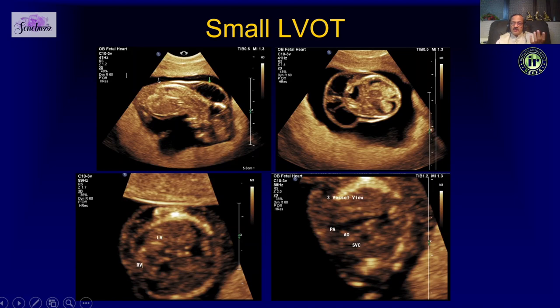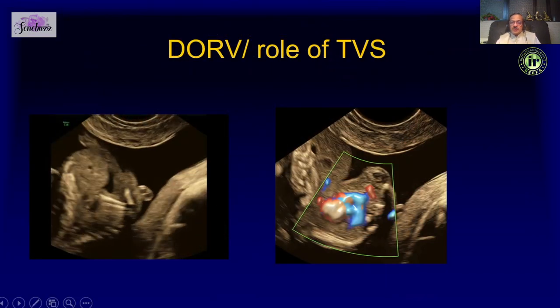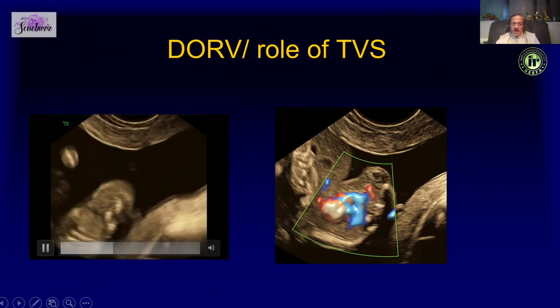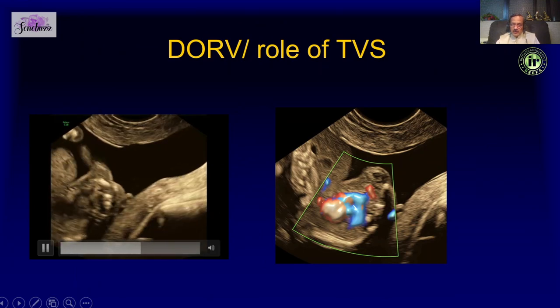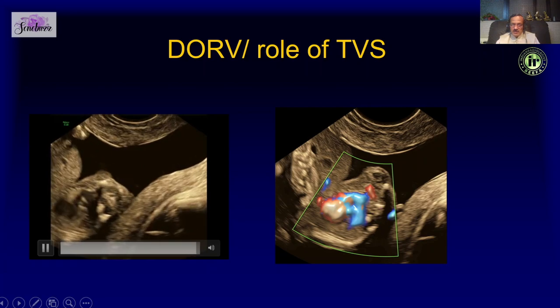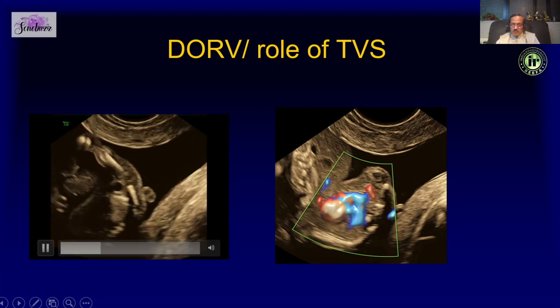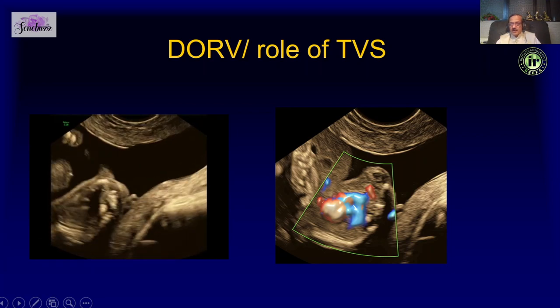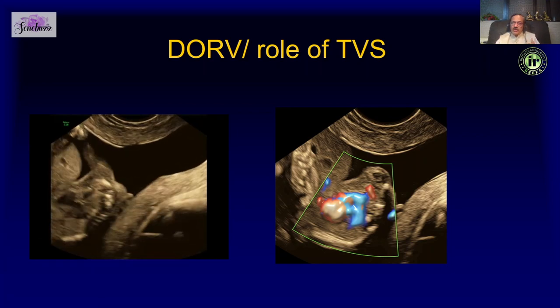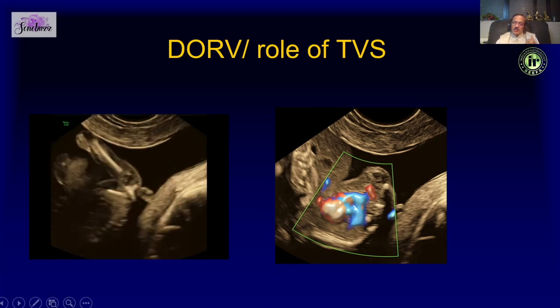This was a fetus with Turner syndrome. Here we have another fetus who had an omphalocele as well — you can see the right ventricle and a large aorta coming from it with a small pulmonary artery. That was a case of DORV (double outlet right ventricle). So a very important thing is the role of transvaginal scans.